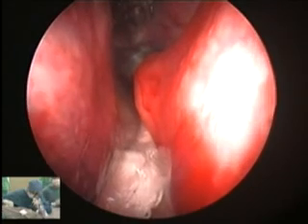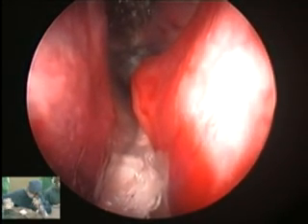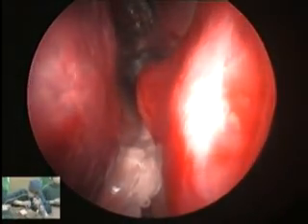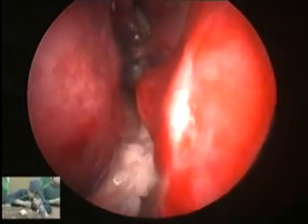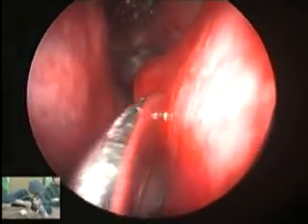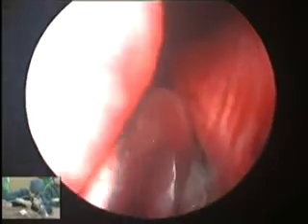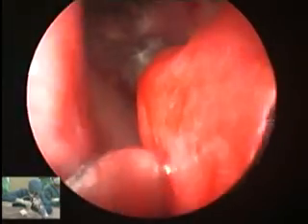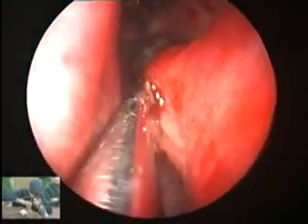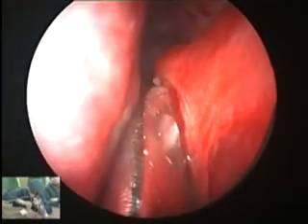Sham, you mentioned you may need to do a septoplasty, but will that suffice if you just take down that little spur rather than a formal septoplasty? Yeah, it would not be a formal septoplasty, but I will just take down this small spur. This is in the way. So I would like to elevate the mucosa and strip it down.